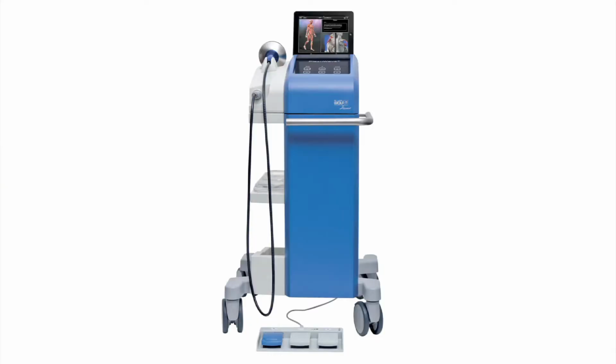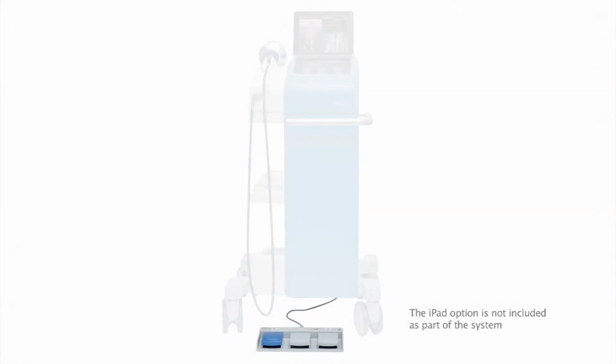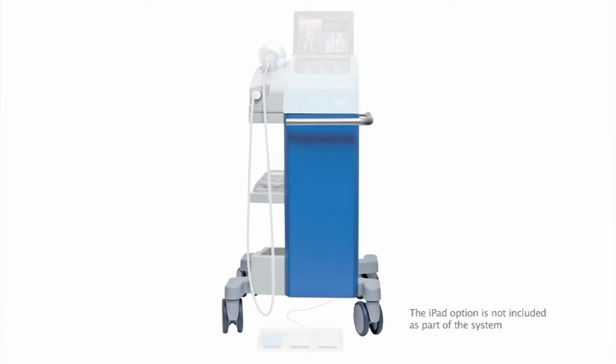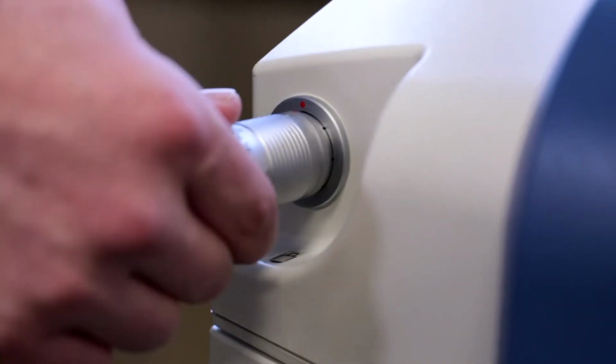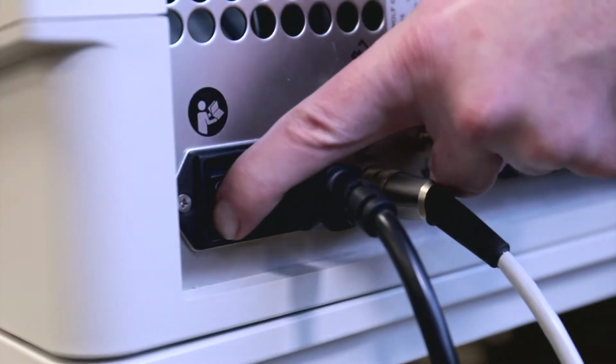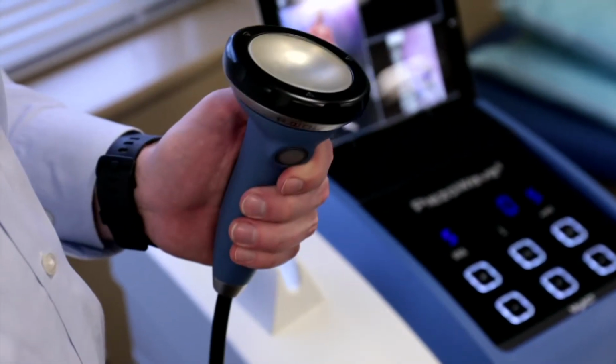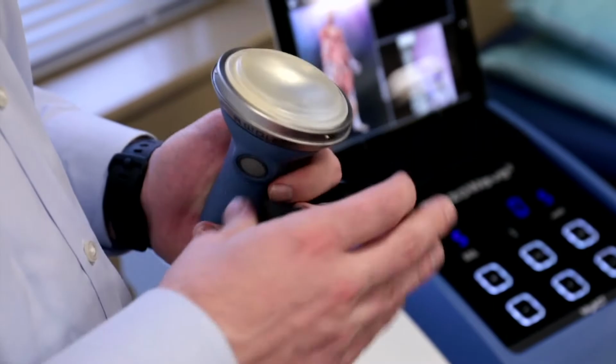The PiezoWave 2 is comprised of the therapy source, control unit, foot switch pedal, and a unit cart. Connect the therapy source to the control unit. With the power cord connected to the control unit, press the power switch on. To prepare the therapy source, turn the black locking ring counterclockwise and remove.